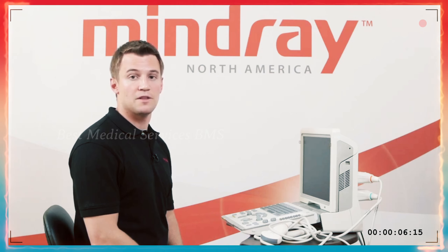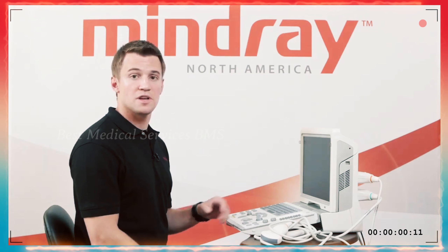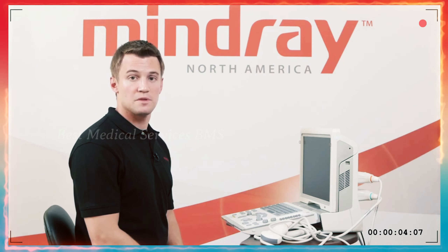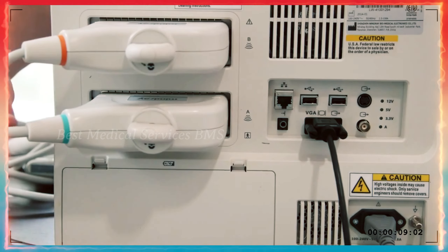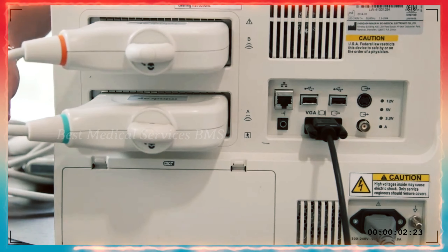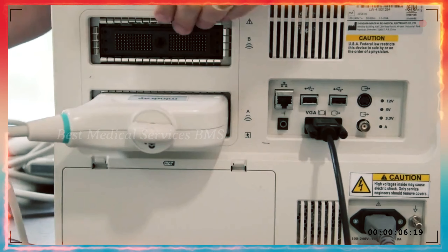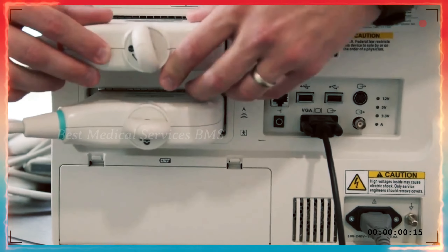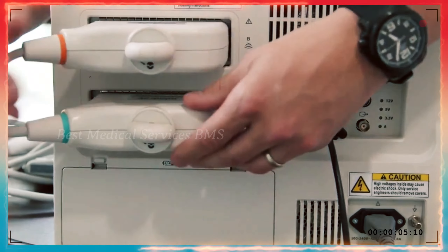We'll discuss the setup of the equipment and the setup menu once we power on the machine. On the back of the Z6, we have a couple of ports where the transducers are plugged in. Once you take them out of their boxes, you can see where they fit on the back of the machine. When you go to put them on, they just slide right in. You won't hear a click or a pop, but you'll turn the little dial and it'll be locked into place. There are two ports — you can have two transducers plugged in at one time.